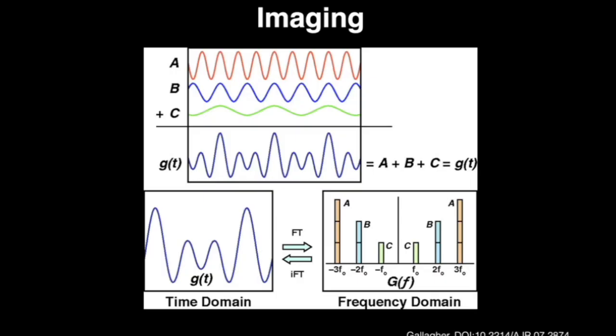So that's the meaning of the amplitudes in this graph, the strength or the amplitude of each of the waveforms up here. When we detect the signal and do this transform, this graph is actually like a 1D representation of our image, like the pixel intensity values that we're seeing in the images that we acquire.